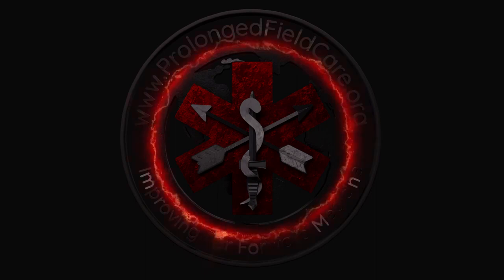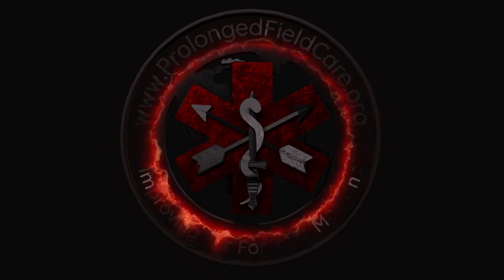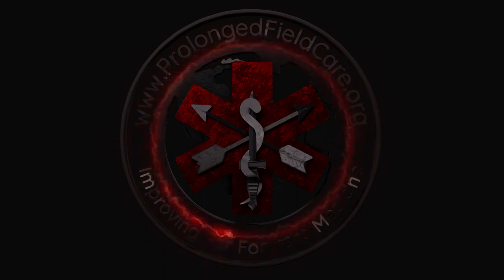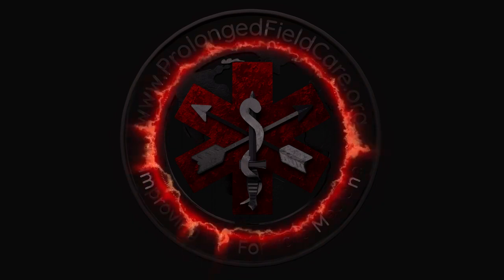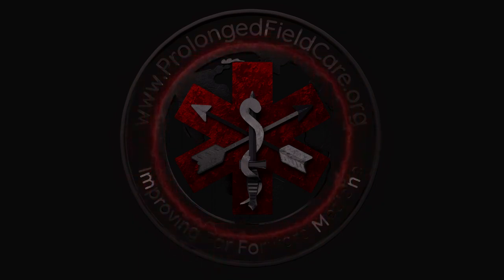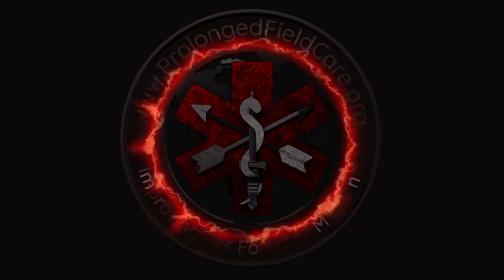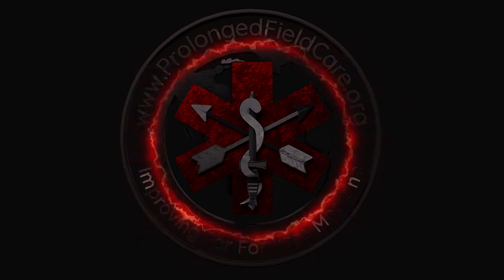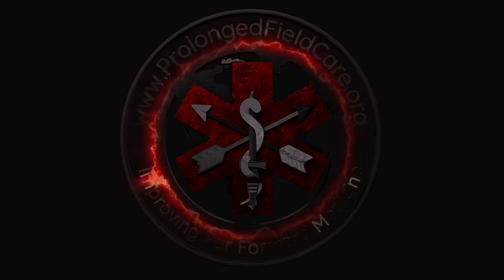If I'm using a BVM to start off with, because the Save 2 just scares the crap out of me, is it okay that I don't bag every breath if I'm just trying to assist them ventilating? I would probably synchronize. Well, it depends how fast they're breathing. Let me take it back. They're breathing 30 times a minute. No, breathe every other breath. If they're breathing something physiologic and it's easy, then I would breathe with them easily.